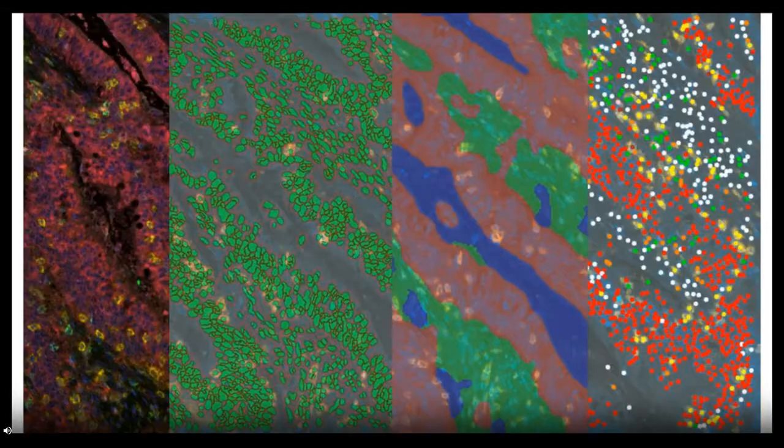out of our lab. So here we're looking at a data analysis workflow from the Vectra scanner, a 7-color fluorescent image on the left, which has been spectrally deconvoluted, and I'll briefly touch on that workflow in a moment. And that deconvoluted image then has had cell segmentation performed on it, the second image on the left. The green objects are the detected nuclei from the blue DAPI stain on the left image, and the red line around that is an estimated cell border.